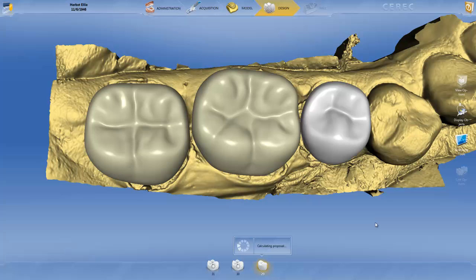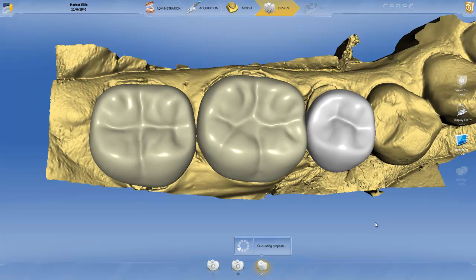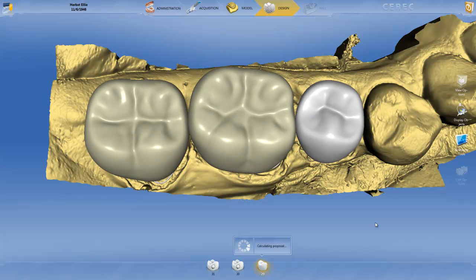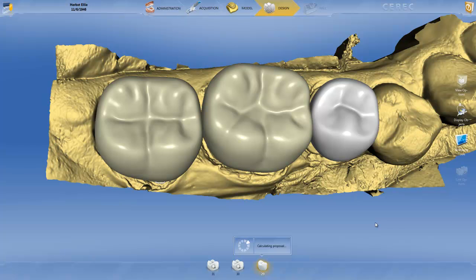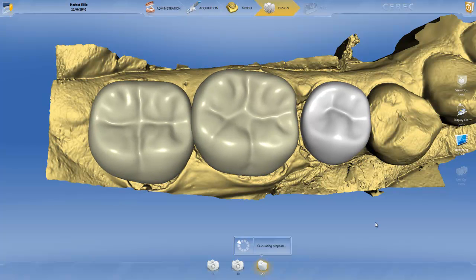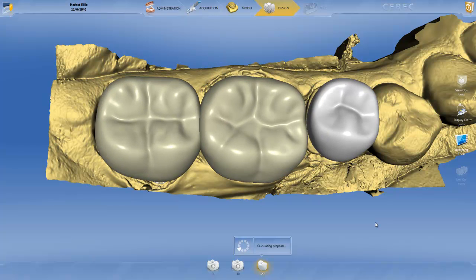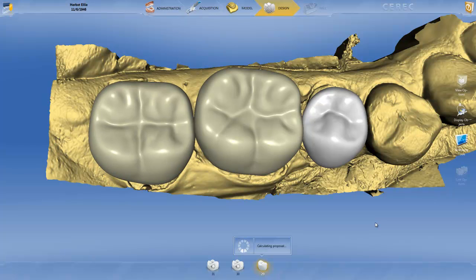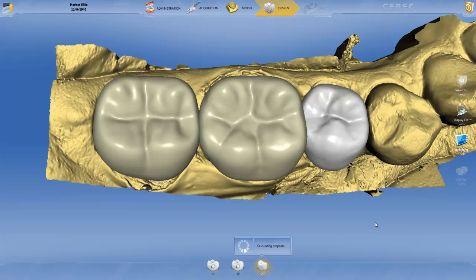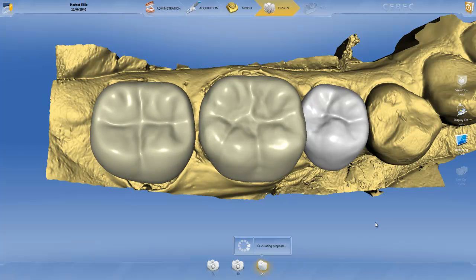So I told you before that I'm going to design 3 teeth at the same time. That's the beauty of 4.0. I could probably break this case down using Sarman's technique, but I want to show you what probably most of the users are going to use and are not familiar with Sarman technique, and what can be done. So as I told you before, I'm going to start from the basic level to show you how I approach this case and what can be done.